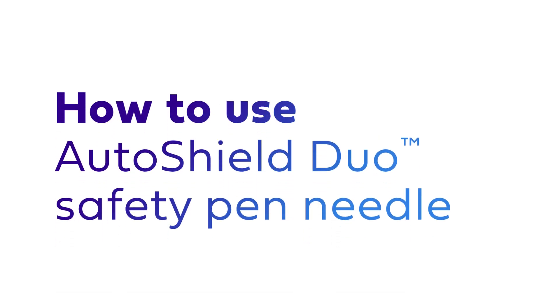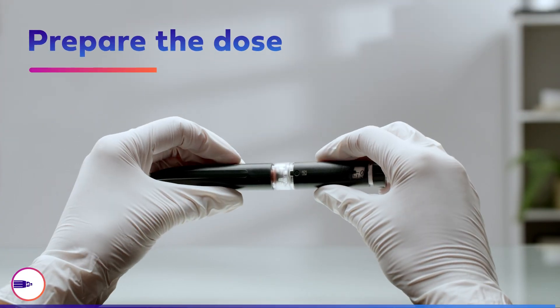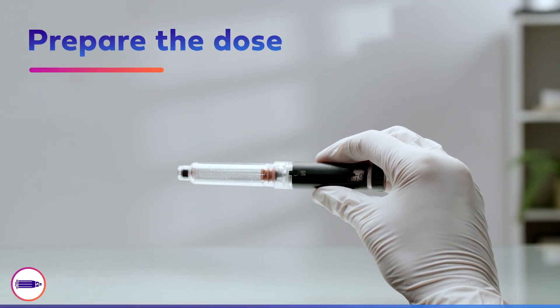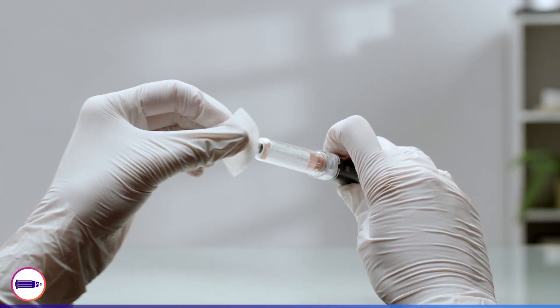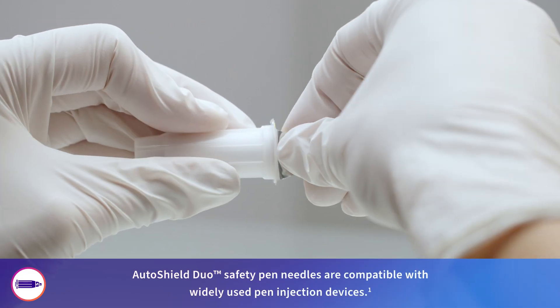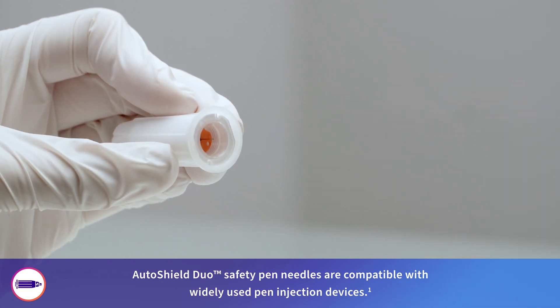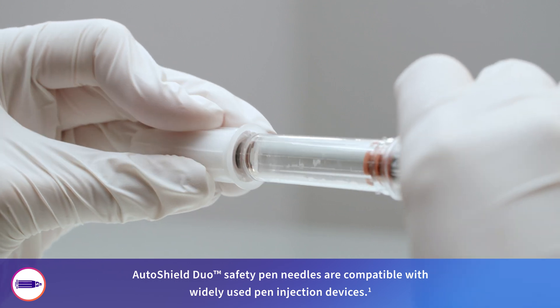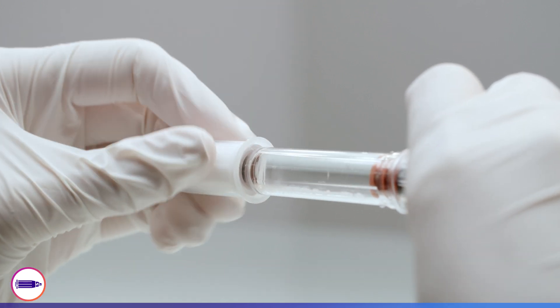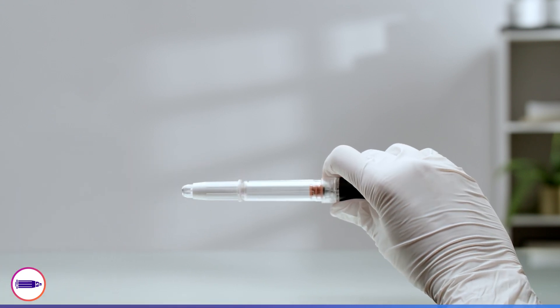Let's review how to properly use the AutoShield Duo safety pen needle. Remove the pen cap and wipe the rubber seal with an alcohol swab. Pull the peel tab off the pen needle. Next, holding the outer cover, screw the pen needle straight onto the pen. Remove the outer cover and check that the pen needle is attached correctly.